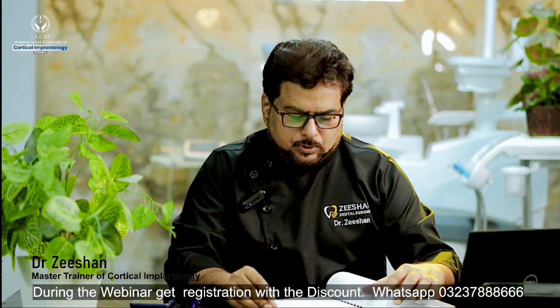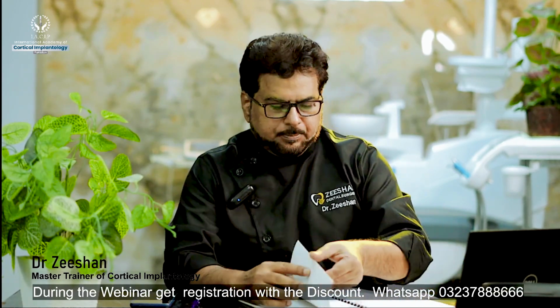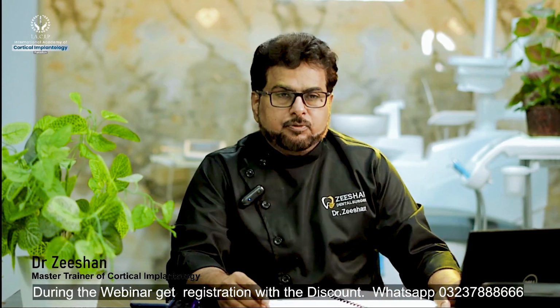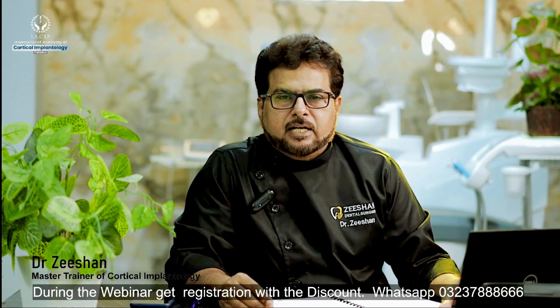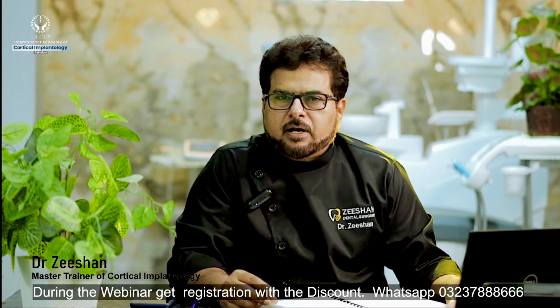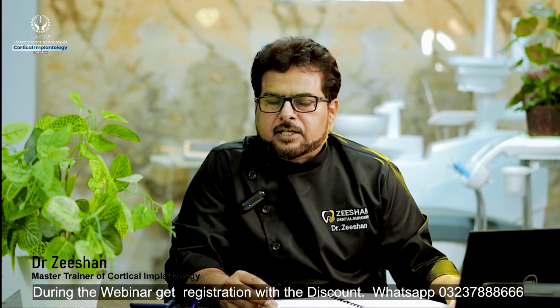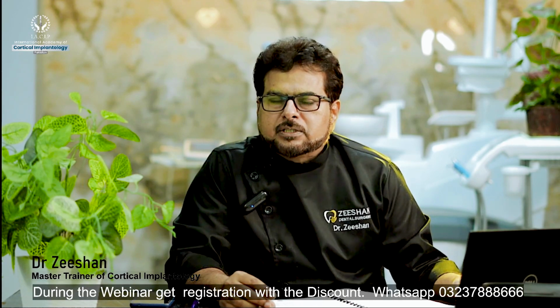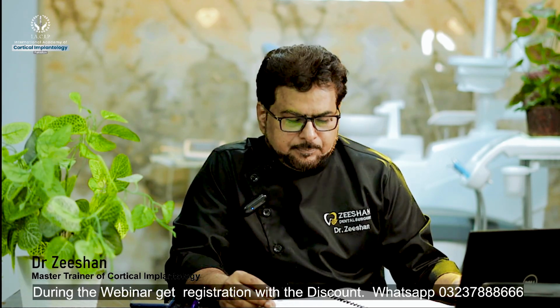Among those, number one is going to be the selection of a patient. So we have to select the patient who should be cooperative, willing for surgery, in good health, and other factors we know. Then we need certain radiographs and other data collection to decide what type of implant and which areas we are using to place the implant, to achieve knowledge about his bone density.